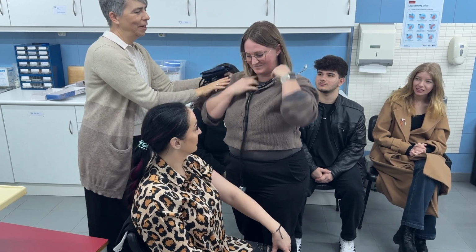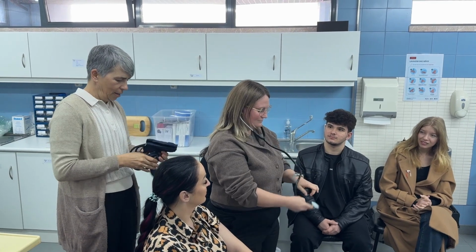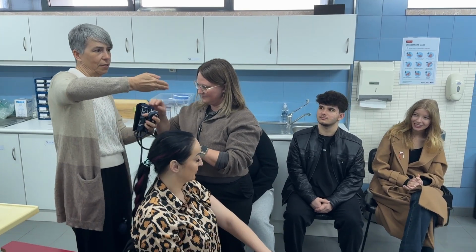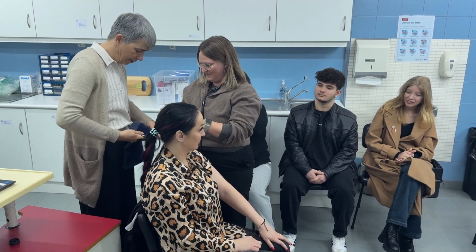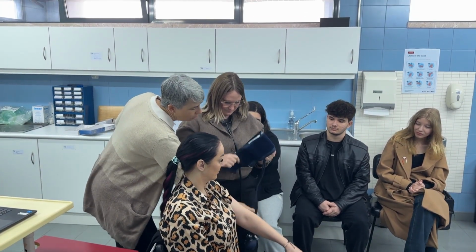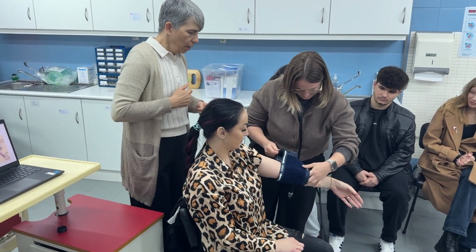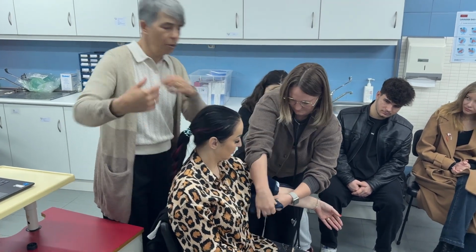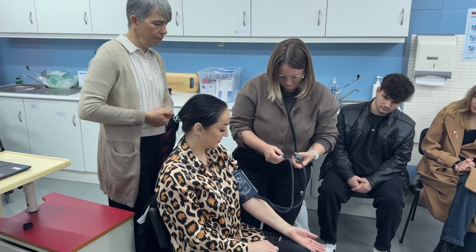So you see, if she turns around, the things are towards her nose. She tests if it's on the right, because sometimes you can swap this thing. The cuff is a bit tight. The cuff has these two things, sometimes integrated in one. So you make sure that, even though they mentioned the artery, you know that the artery is in the inside part of the arm. So these two things should be there.